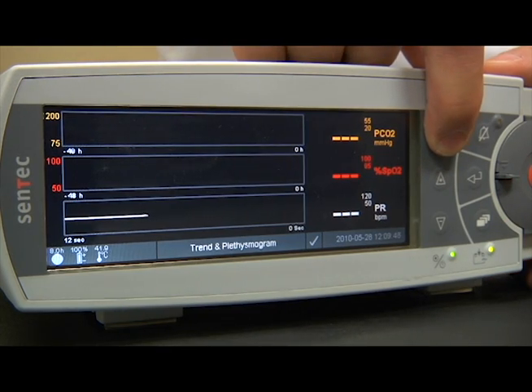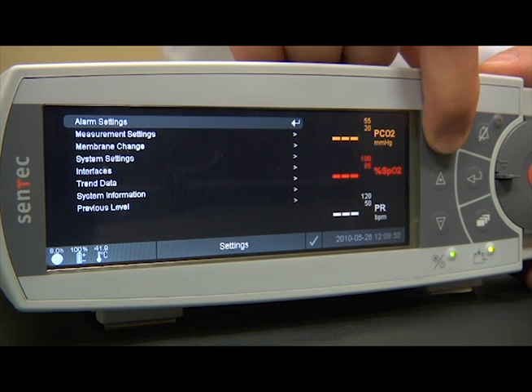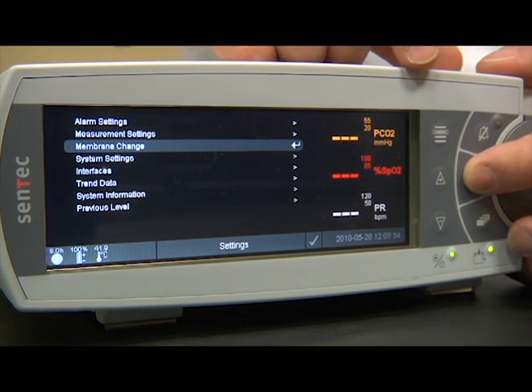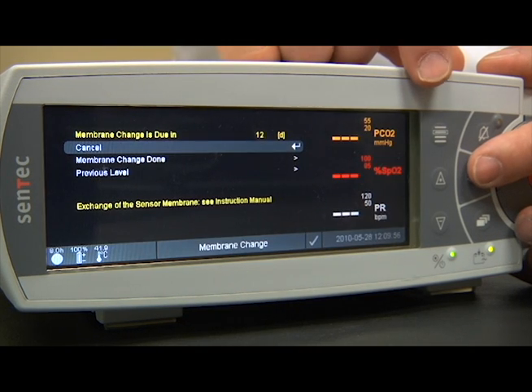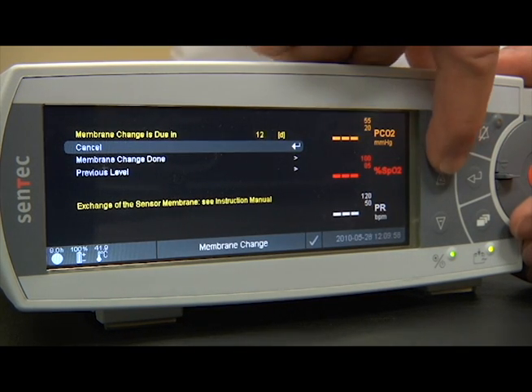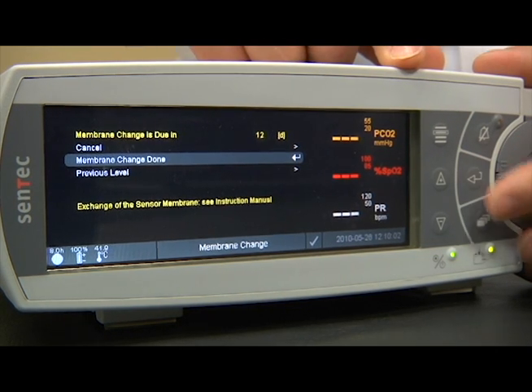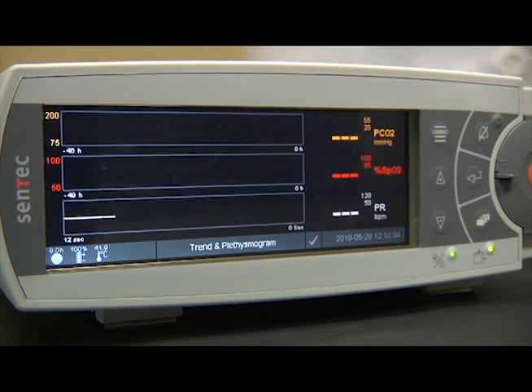Make sure to confirm the membrane change on your monitor in order to reset the membrane timer. Your V-Sign sensor is now ready for use.